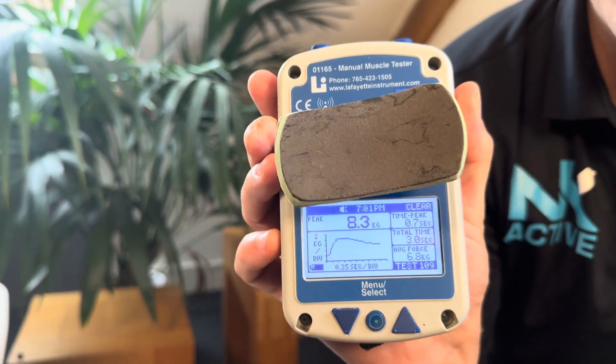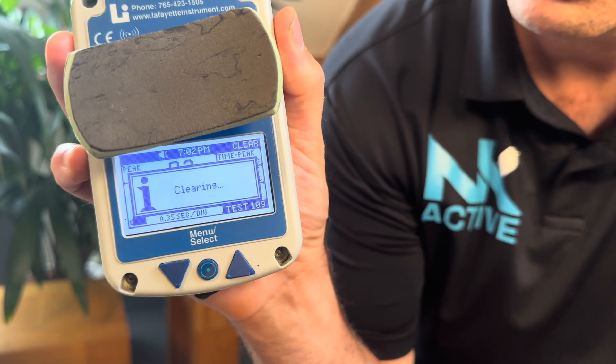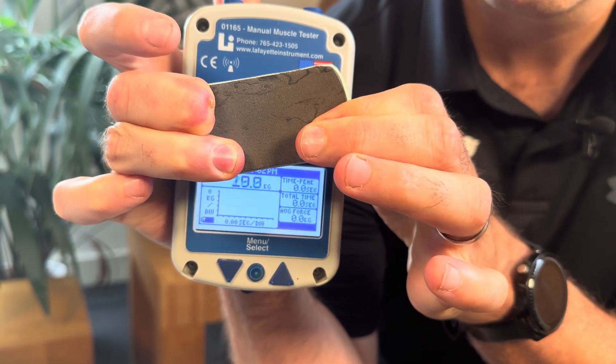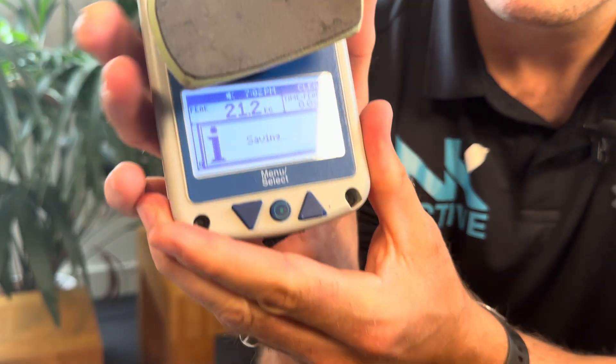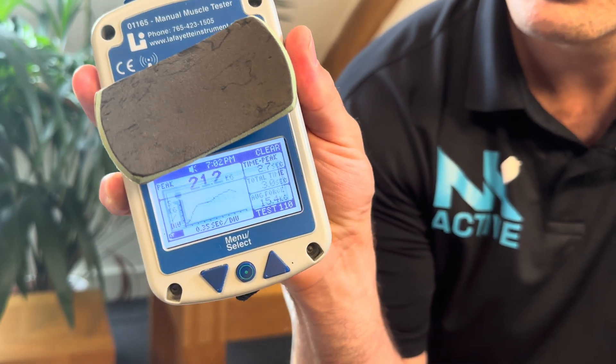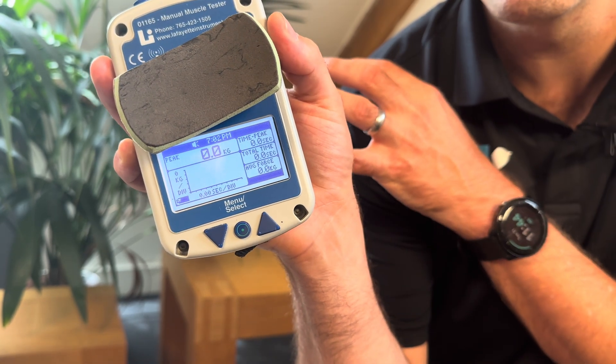The Active Force will set you back around £410, and that includes access to the software. Next, we have our good old trusty Lafayette. You'll notice it has an LCD screen. I'm going to zero it off and you push — once it gives a series of beeps, it tells you how hard you are pushing. You just clear and go again, so you don't need to recalibrate this every single time.